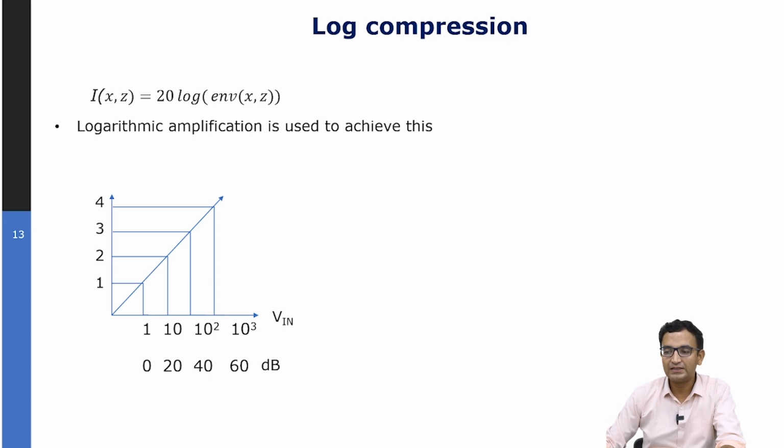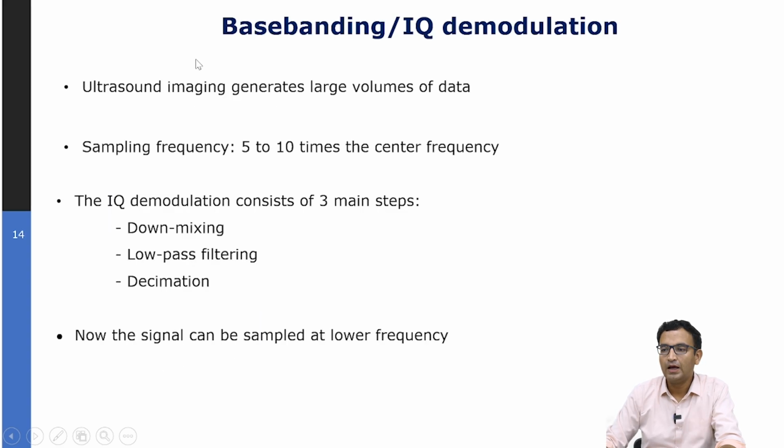Now we are not going to discuss the details of the amplifier or the hardware implementation of the amplifier, but this is something for you to look up. Next, let's discuss basebanding or IQ demodulation.